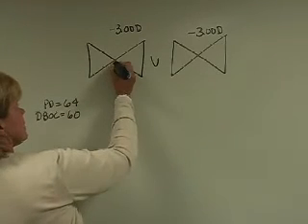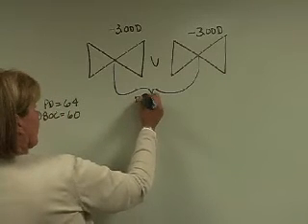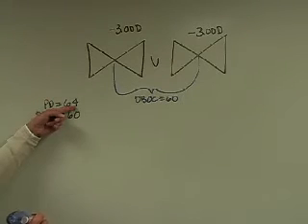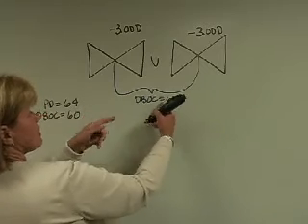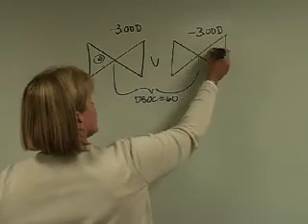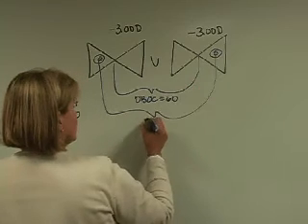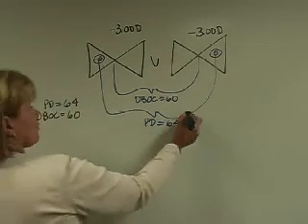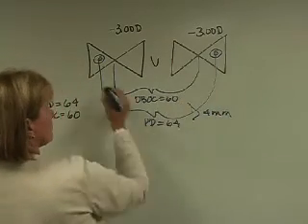Where the apices meet here is the distance between optical centers, so we can mark that and label that DBOC equals 60. And the patient's PD is actually greater, so we know that the patient has to be looking outside that optical center separation because that's only 60. So perhaps the patient's looking somewhere over here in this lens, and we can mark that as the PD equals 64. So the patient is looking 4 millimeters off for both lenses. Take this amount and this amount totals 4.